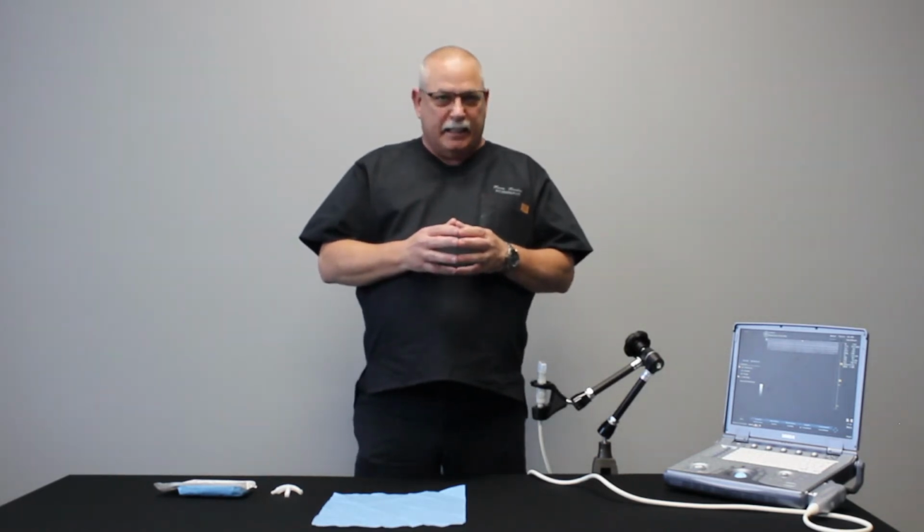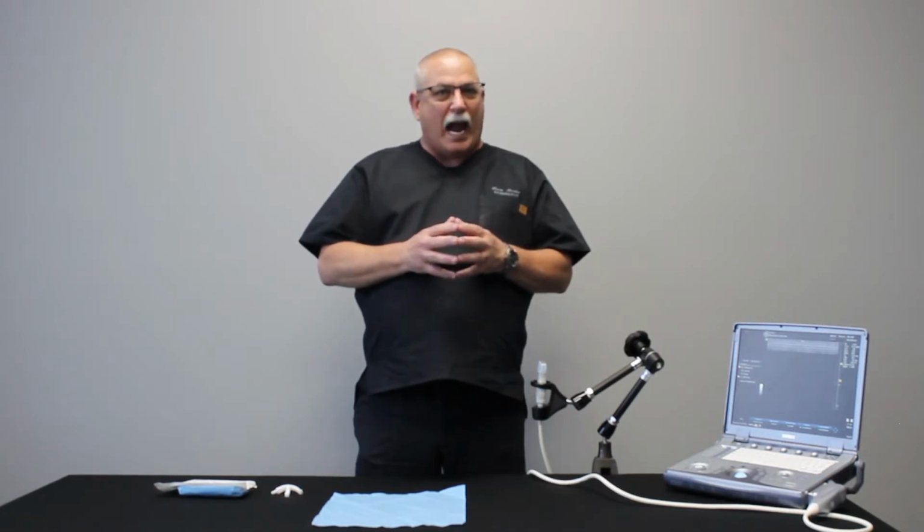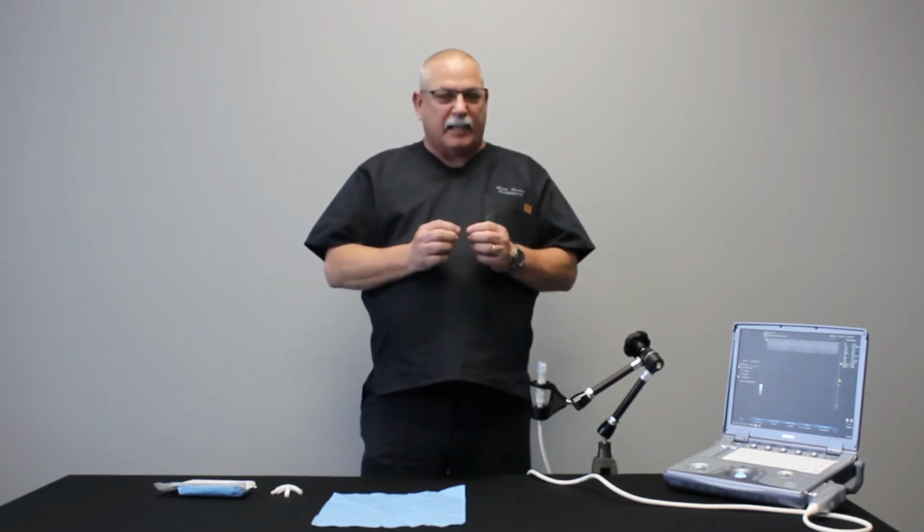I'm a clinical marketing specialist here at Citco Medical Solutions, and today I'm going to demonstrate for you how to assemble the AccuSITE Needle Guide. The AccuSITE Needle Guide is a little unique in that it is for out-of-plane needle placement procedures.